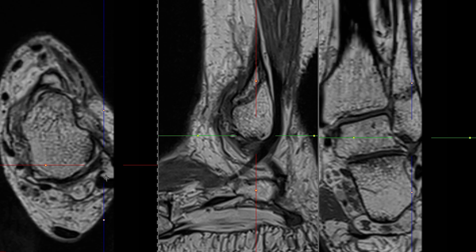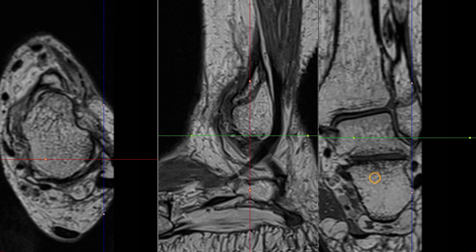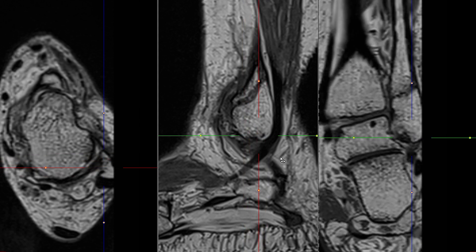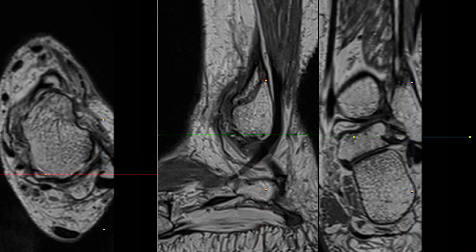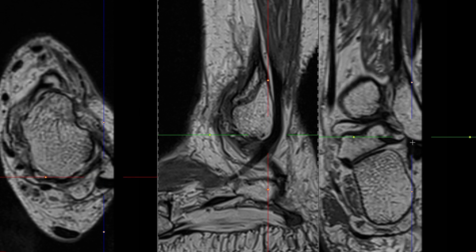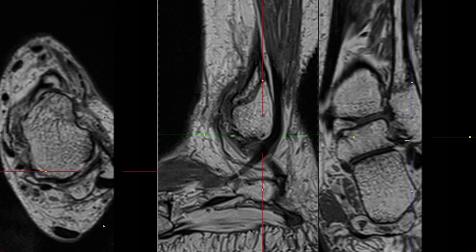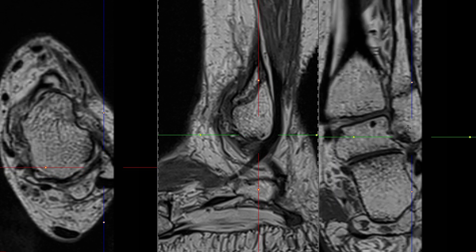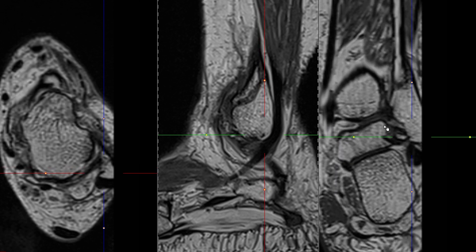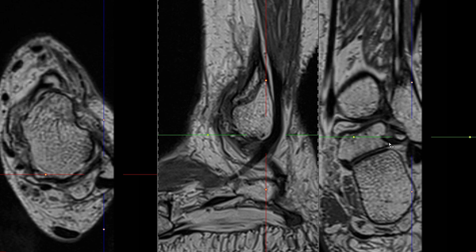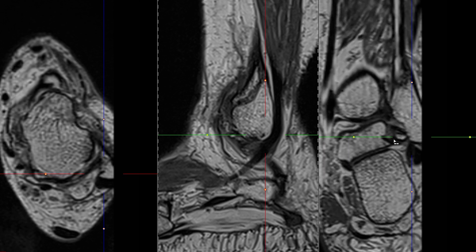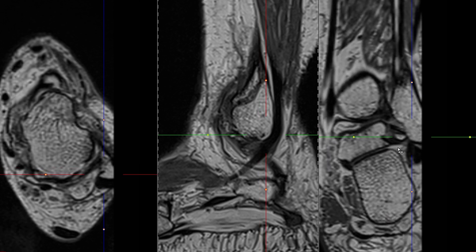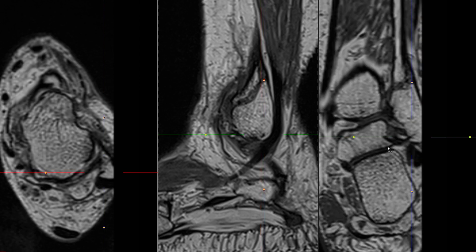Let me show you the PTFL in another patient with a fibular fracture. On the posterior aspect of the fibula you can see these band-like ligaments running from the tip of the fibula over to the posterior aspect of the talus. Sometimes you have fat in between these fibers, and sometimes there is fluid — both are still considered to be normal findings.